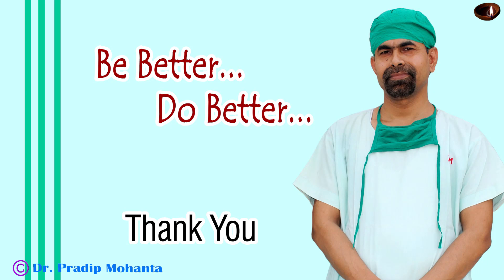Thank you very much for your attention. Hope this video will help you in developing your surgical skills. When there is a lot of cortical lens matter left, as in this case, be careful as you pull the cortical lens matter. The pull should be gentle, not vigorous. Hold a small amount of cortex and pull. If you hold a large amount of cortex and pull it vigorously, there may be zonular dialysis.